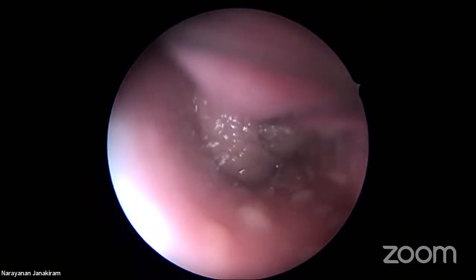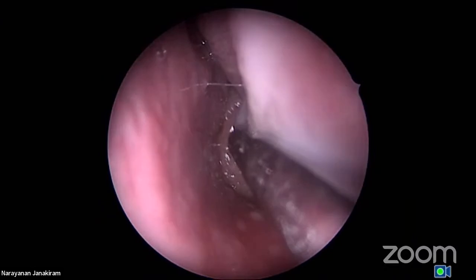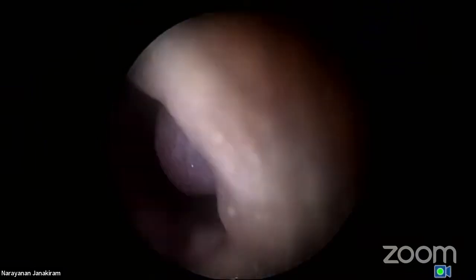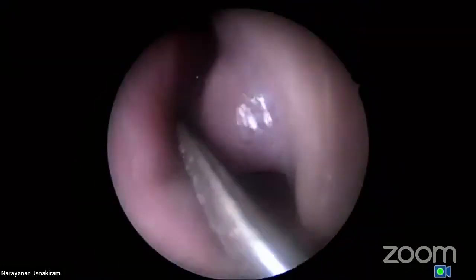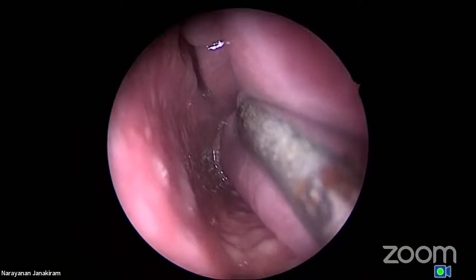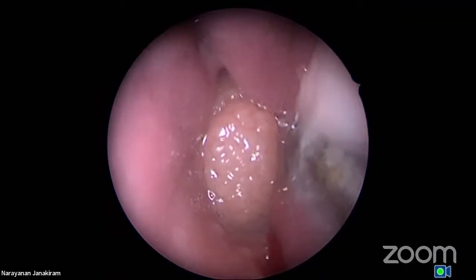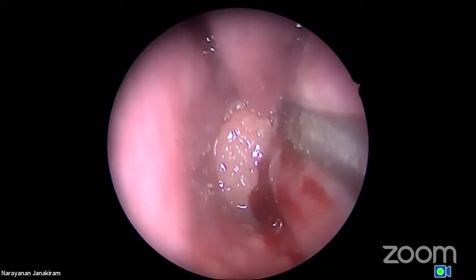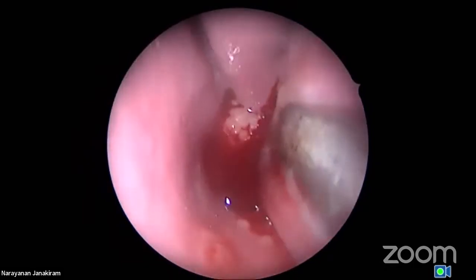See the adenoid. See what's happened now? You see? It's completely blocked the nasal cavity. Can you see that? So the first step again is lateralization of the inferior turbinate. How do you think this child would have breathed air through the nose? It's almost impossible. See here. Can you see that? Oh my God! See that? This is pathetic. So it's an absolute indication for surgery. You understand? So this will lead to sinusitis very often, and sleep apnea.